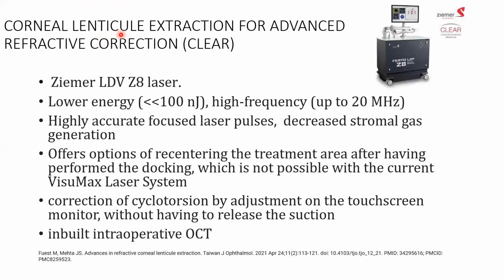In corneal lenticule extraction for advanced refractive correction, CLEAR by Zemer LDV Z8 laser, like I mentioned before, it has a low energy and high frequency laser, and it also offers options of recentering the treatment area after performing the docking, which is not possible with the current VisuMax laser system. It also offers cyclotorsion control without having to release the suction, and it also has an intraoperative inbuilt OCT.